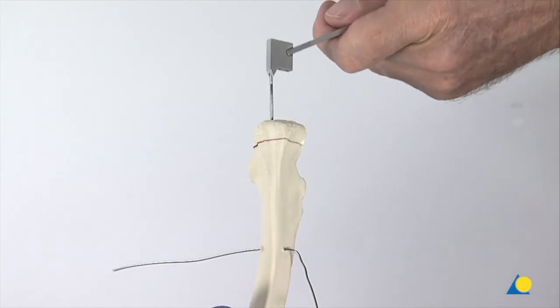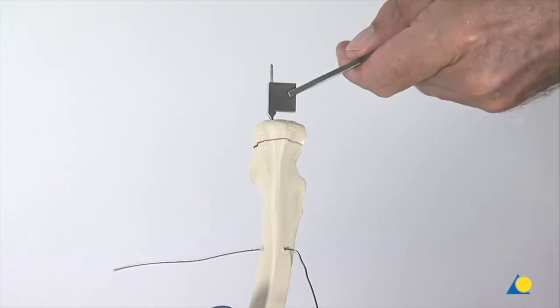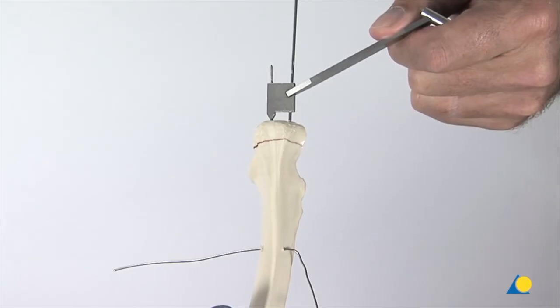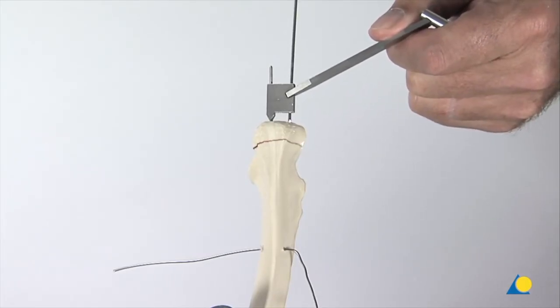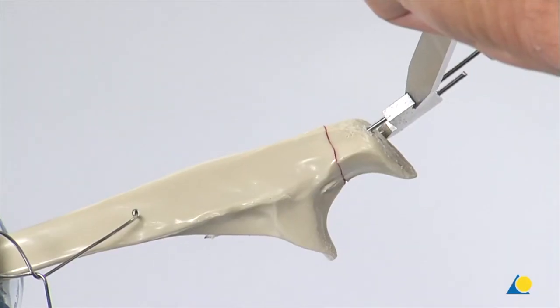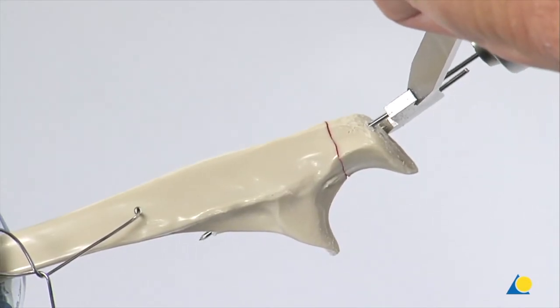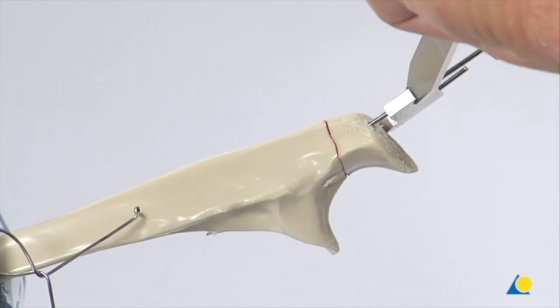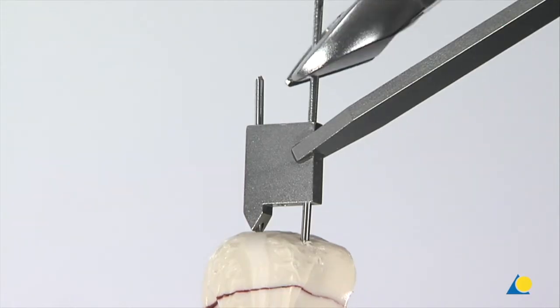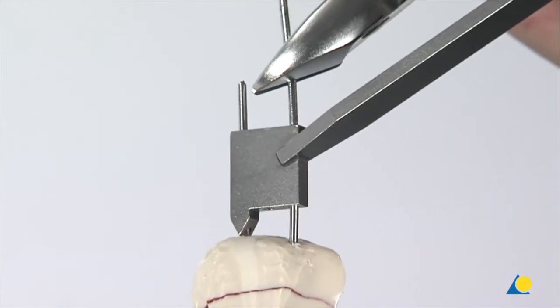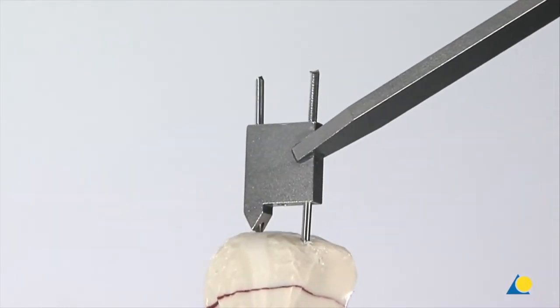The drill guide is put back in place and positioned for the introduction of the second K-wire, parallel to the first. After perforating the anterior cortex, this K-wire is also retracted 1cm. The second K-wire is also cut obliquely with the wire cutters. The drill guide is removed.